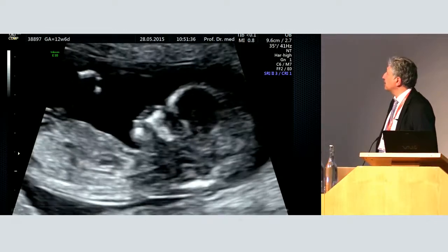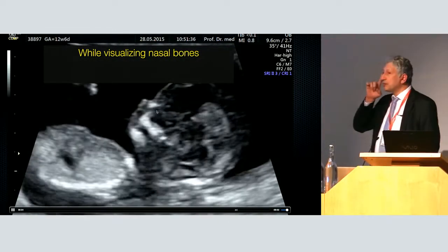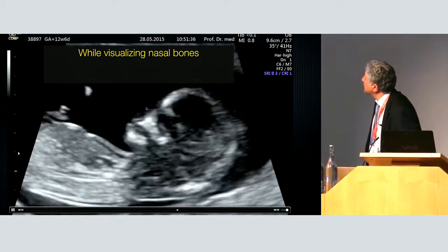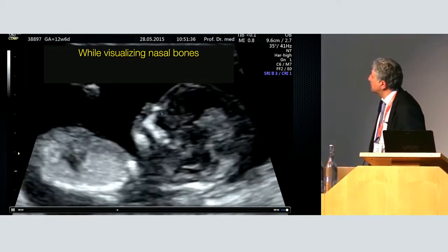Yes, we are seeing the maxilla very well, because once we are checking the nasal bone, we were taught to go from one processus maxillaris to the other and to observe here that the nasal bone is present not where the process was, but exactly between.